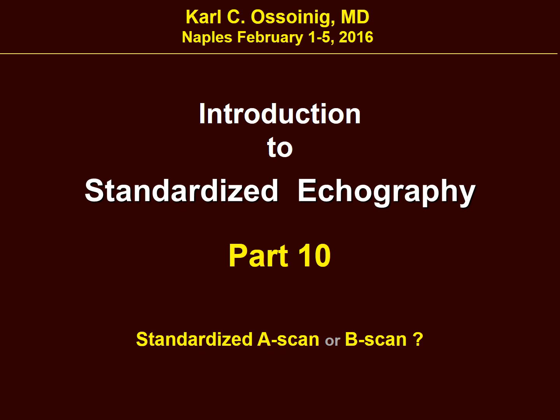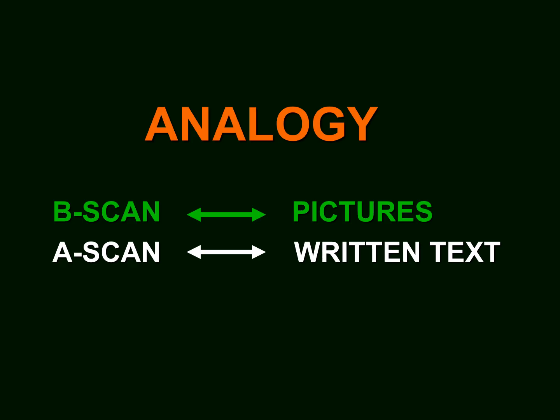In part 10 of this introduction to standardized echography, we will raise and answer the question: should in a particular case standardized A scan be used or B scan, or maybe both? There is an analogy. The B scan is like pictures, whereas the A scan is like a written text.